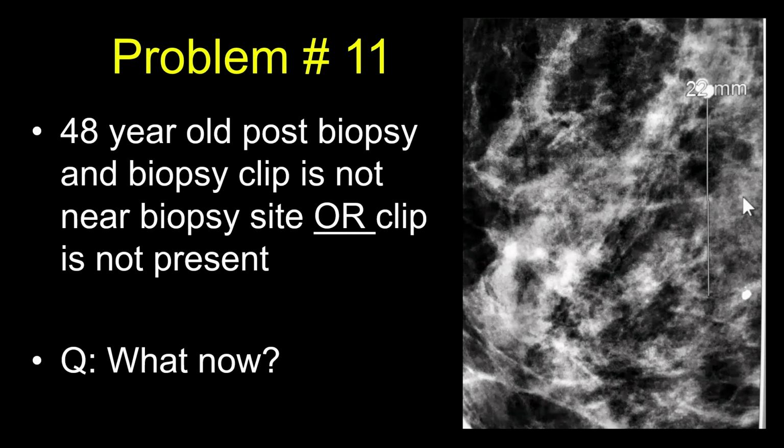I mean, I can't imagine this happens to any of you guys, but those biopsy clips are perfect, aren't they? They clip right where you took the sample. No, don't you wish?